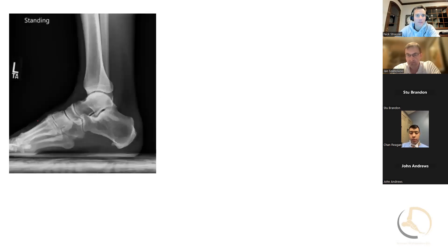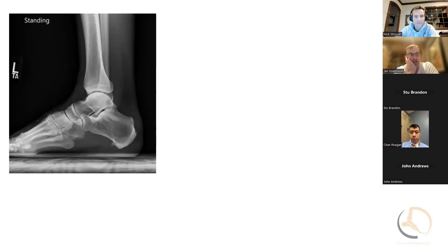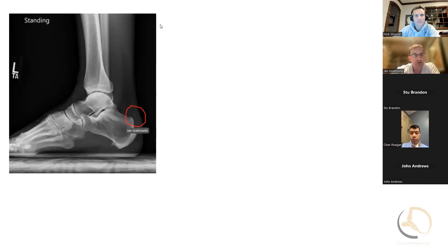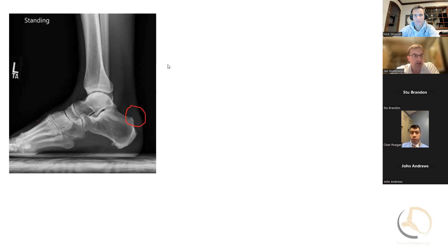So how are you approaching this if this is his X-ray? The same thing — after examining them, this is very different than the last X-ray we saw. You do not see as much calcification along the heel, along the insertion of the Achilles. This is one where I wouldn't get an MRI right away. I'd treat them with therapy, maybe immobilization. And then if they fail all that conservative management, then I would get an MRI to look at the Haglund's, the tendon quality, and so forth.